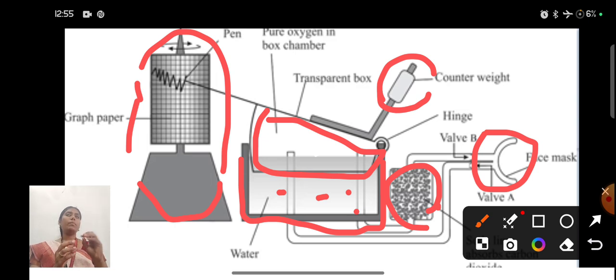Once or thrice we do this process during the experiment, the CO2 will start to accumulate. When the same person inhales during the test, the excess CO2 will get into the body and will lead to some side effects. In order to avoid that, they have included the canister with soda lime. The property of soda lime is that it absorbs the excess CO2.